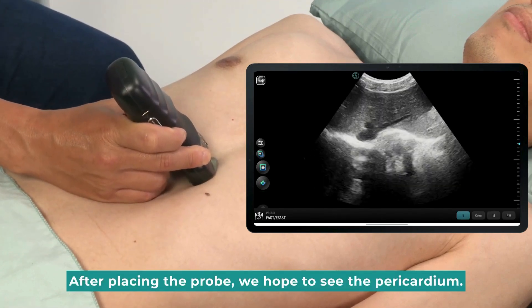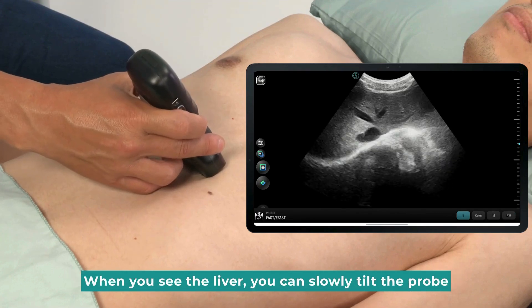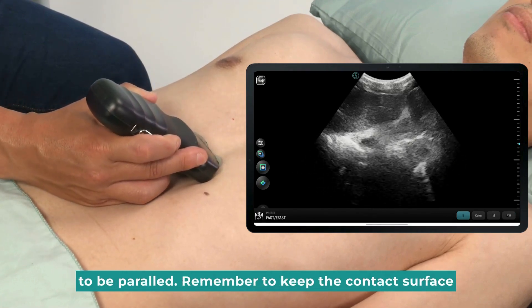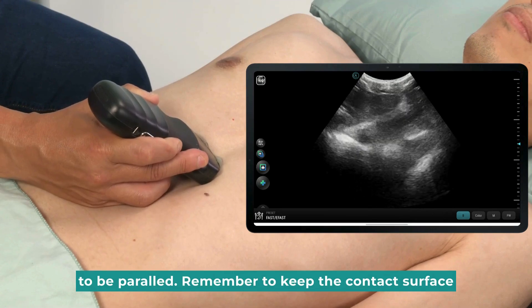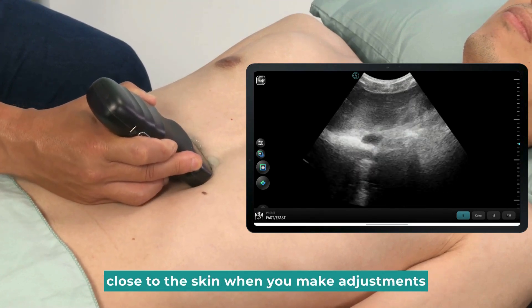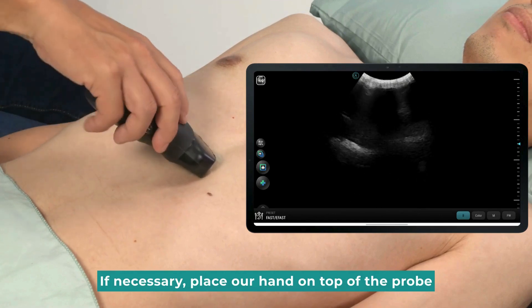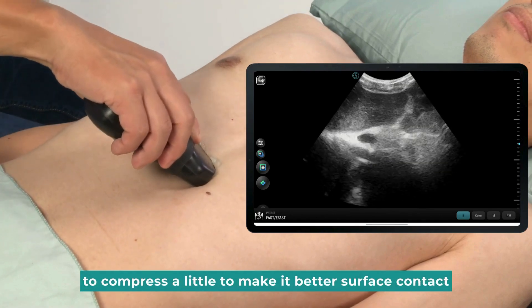After placing the probe, we hope to see the pericardium. When you see the liver, you can slowly tilt the probe to be parallel. Remember to keep the contact surface close to the skin when you make adjustments. If necessary, place your hand on top of the probe to compress a little to make better surface contact.